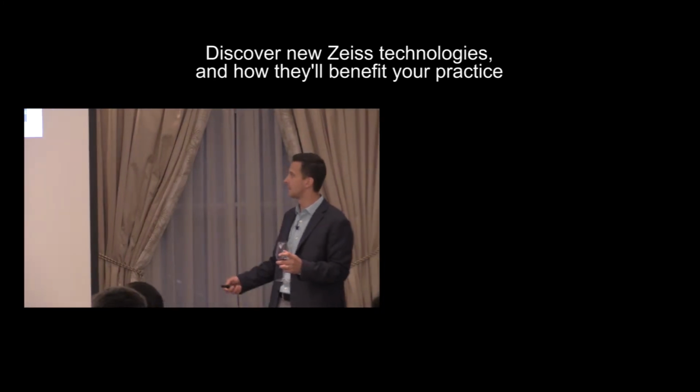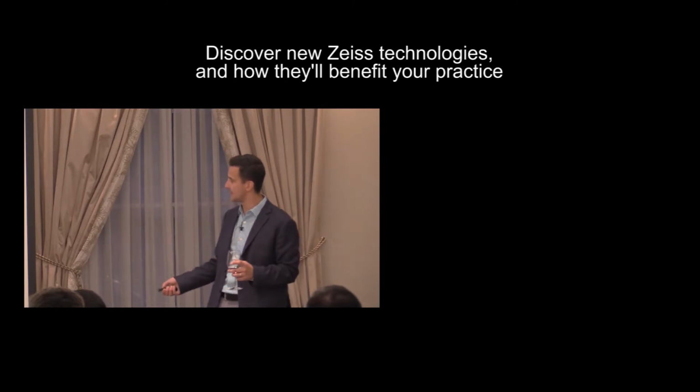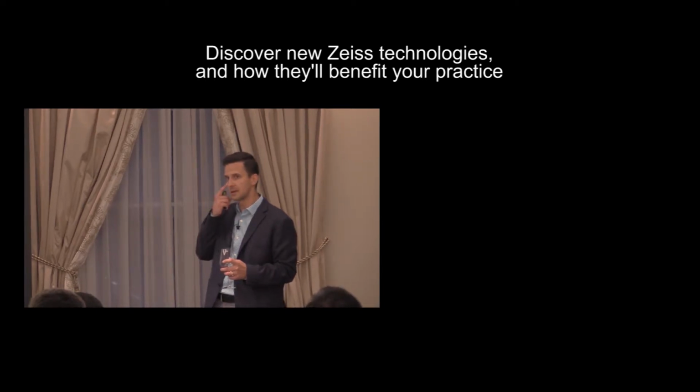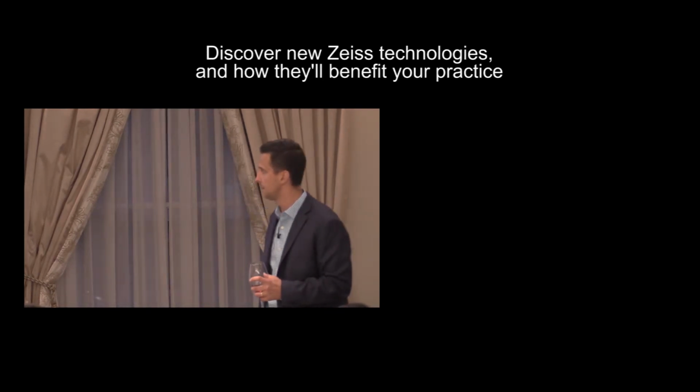Diabetic retinopathy, again, is another example of the quality that's there. And then we're all familiar with these eyelashes, which are really still difficult to get out of the way in current ultra-wide field technology. That's what you can do when you gently pull down on that eyelid or eyelash and take these wide field images.